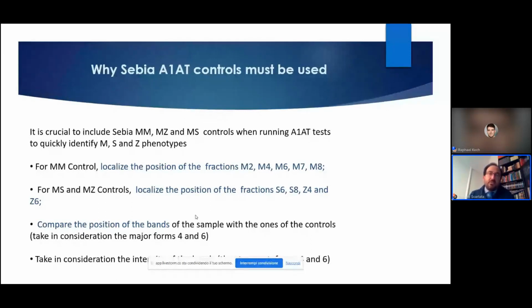And similarly, you have the position of the fractions S6, S8, Z4, and Z6 for the pathological presentations.